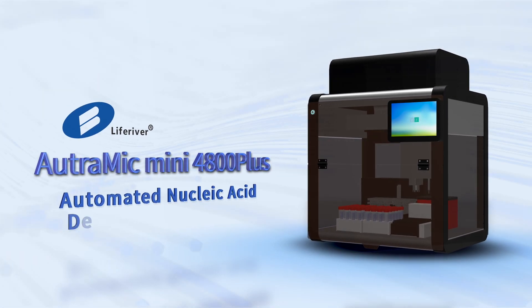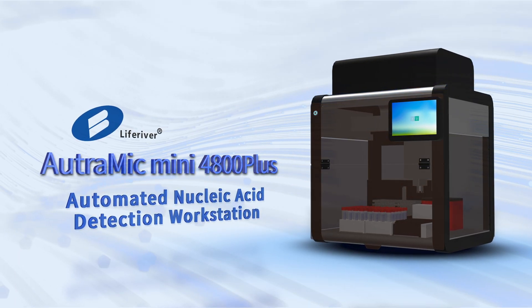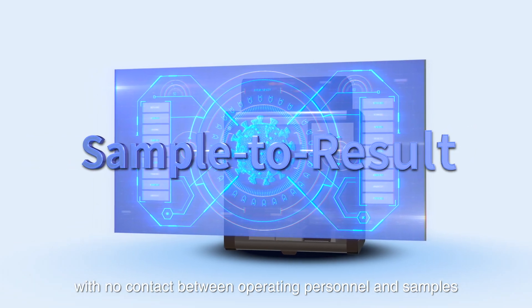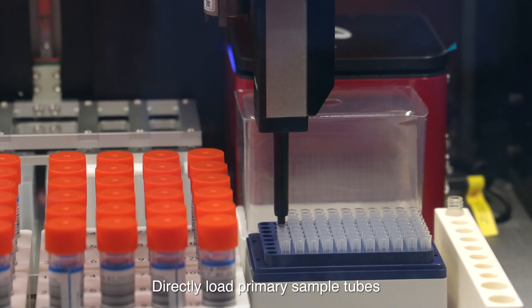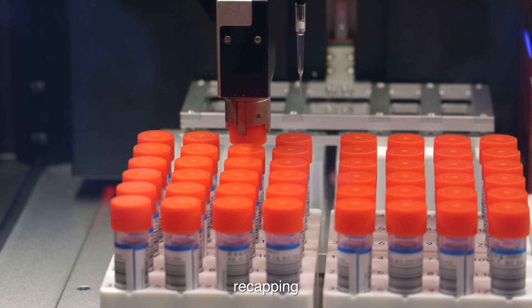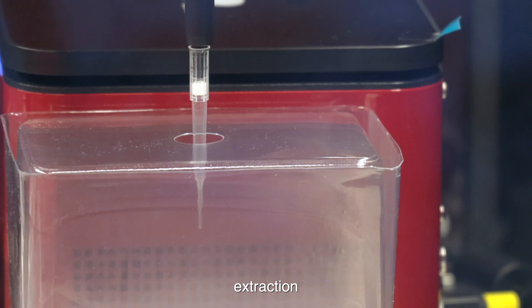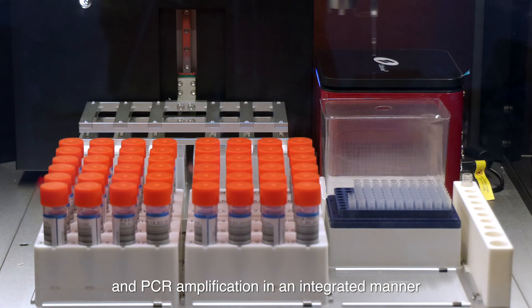Liferiver AutraMic mini 4800Plus Automated Nucleic Acid Detection Workstation offers you a sample-to-result operation experience with no contact between operating personnel and samples. Directly load primary sample tubes with automated decapping, recapping, and sample pipetting to realize the whole process of sample distribution, extraction, PCR setup, and PCR amplification in an integrated manner.